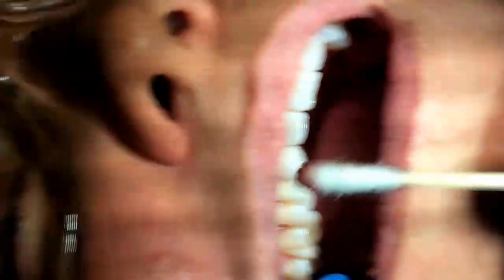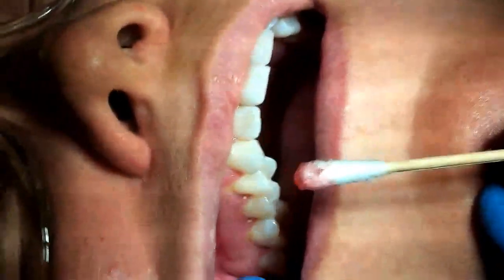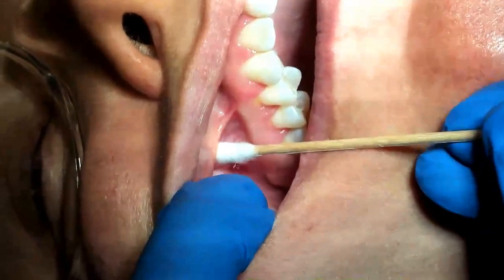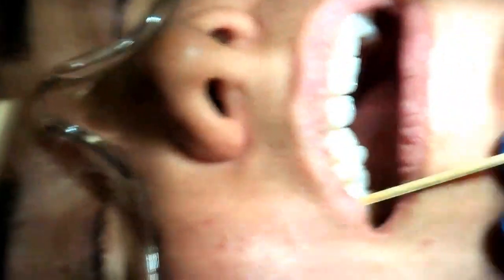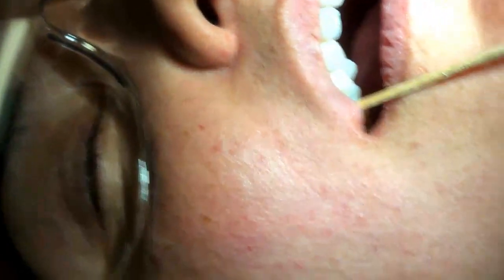Then we're going to apply our topical anesthetic. You just want a little bit of topical anesthetic on the tip of a cotton-tip applicator — you don't want a big glob. You don't need a lot of excess because it's powerful and it does what it's supposed to. Place the topical at the site for a one to two minute period of time, just let that sit and soak in so that the patient's getting nice and numb.